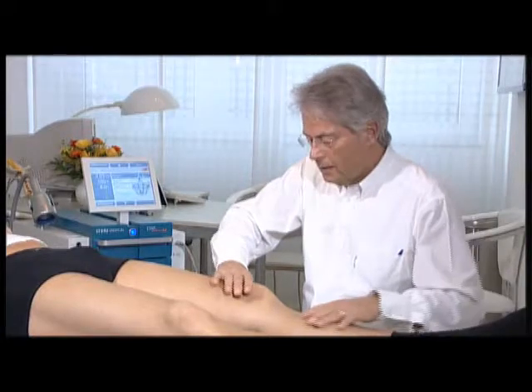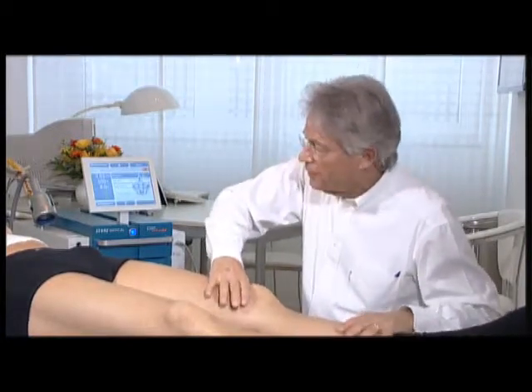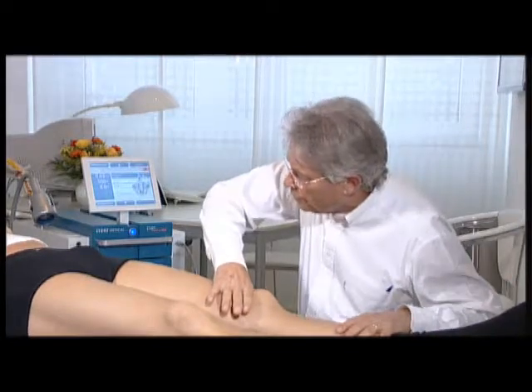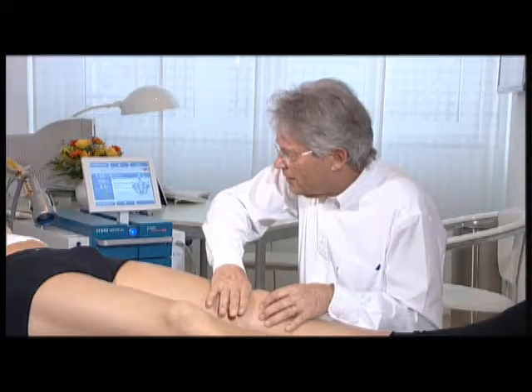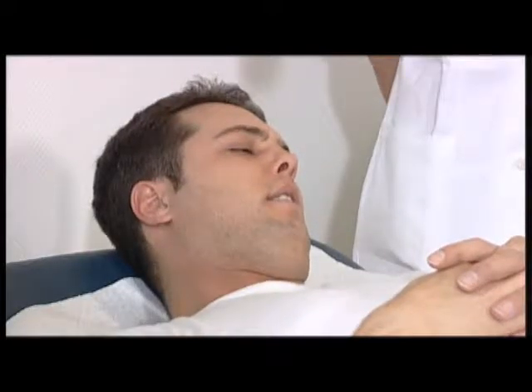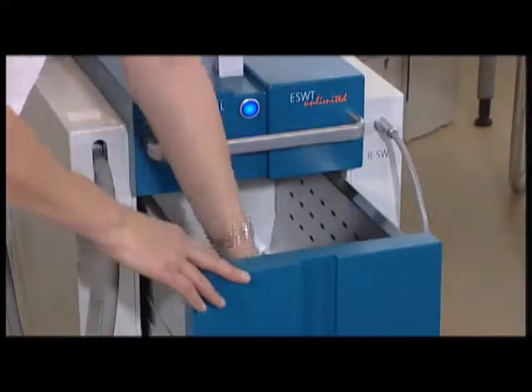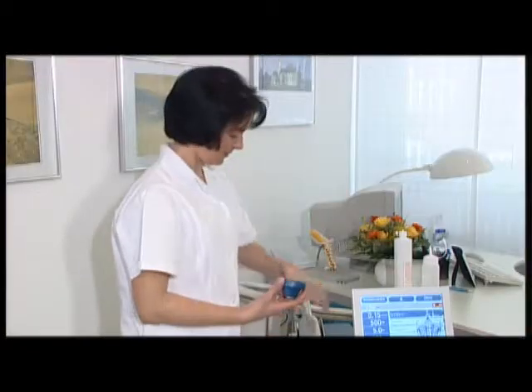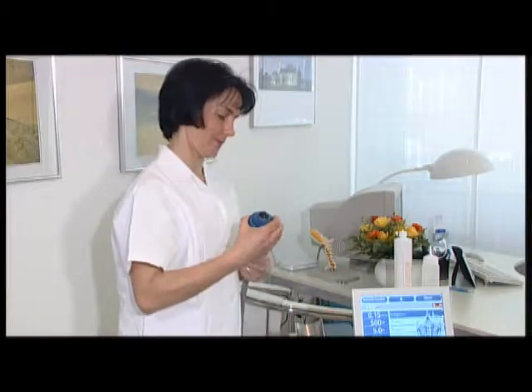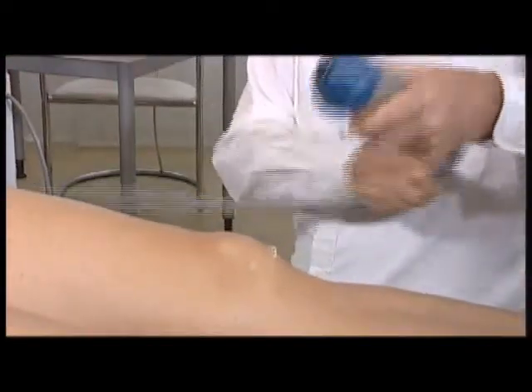Patellar tendonitis is a frequent form of insertional tendonitis, especially among amateur sports people. The painful spots are localized by flat palpation and by pressing the patella upwards. Owing to its unparalleled versatility, the Duolith SD1 also opens up new possibilities for diagnostic applications. Precise localization of the painful spots is ensured by using focused shockwaves.